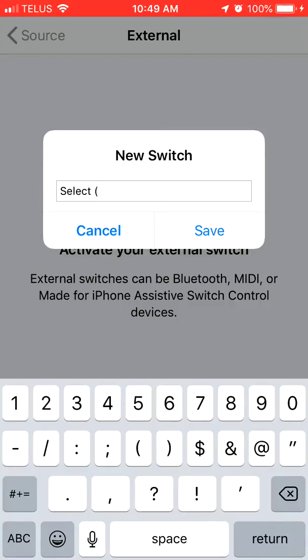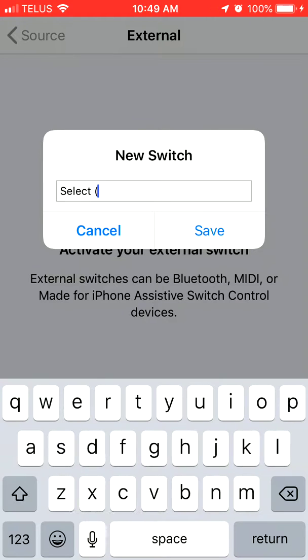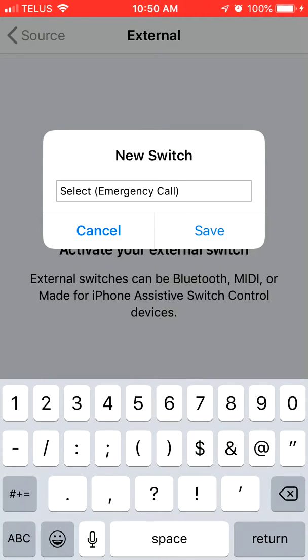to either someone, a friend that VISAIDE Smart Cane is configured to call, or an emergency call. So we will label this as emergency call, even though the function may be designated to just call a friend. And again, the middle button is labeled with a C in Braille, just like the upper right button was labeled with a V in Braille and the upper left button was labeled with a T.